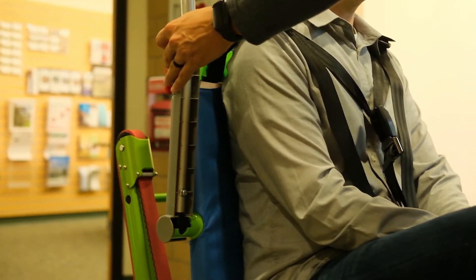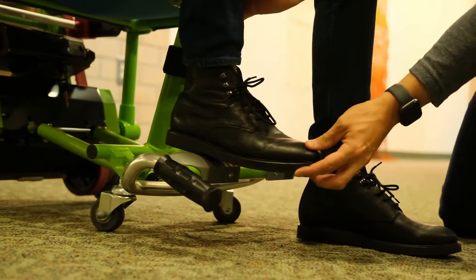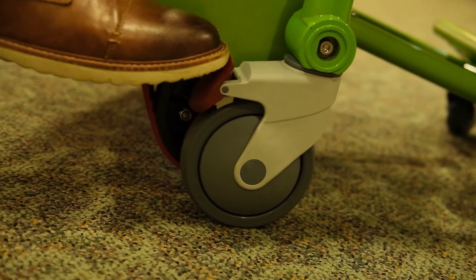Lower the armrests which, if required, can be used to support the transfer. Then open out the footrest and you're ready for your exit. Once the person is in the chair, release the brake mechanism by placing your foot on top of the red footpad and pressing down.